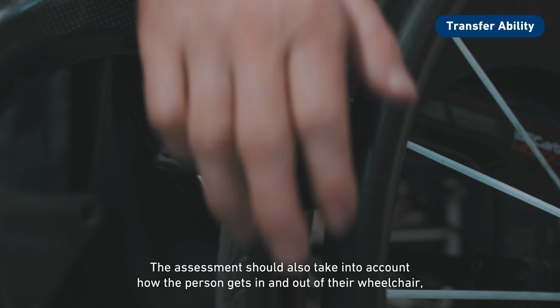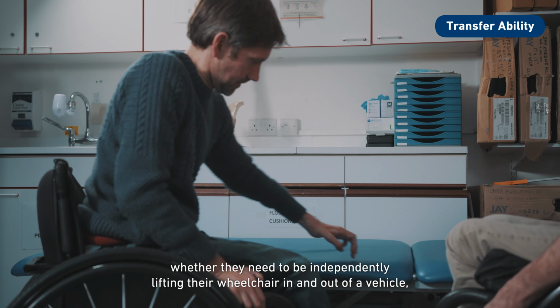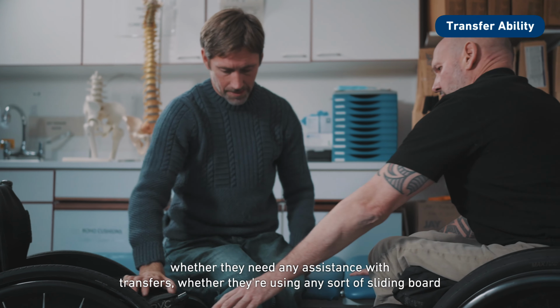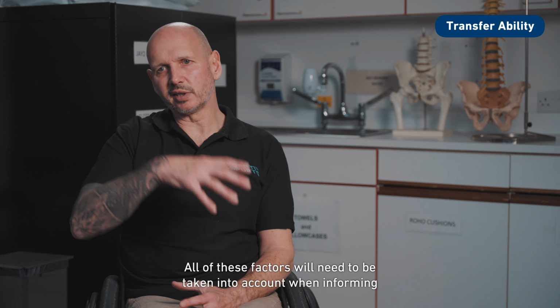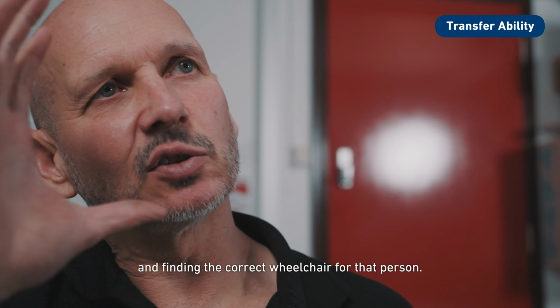The assessment should also take into account how the person gets in and out of their wheelchair, whether they need to be independently lifting their wheelchair in and out of a vehicle, whether they need any assistance with transfers, whether they're using any sort of sliding board or being hoisted, whether any carers are involved in the transfer process. All of these factors will need to be taken into account when informing and finding the correct wheelchair for that person.